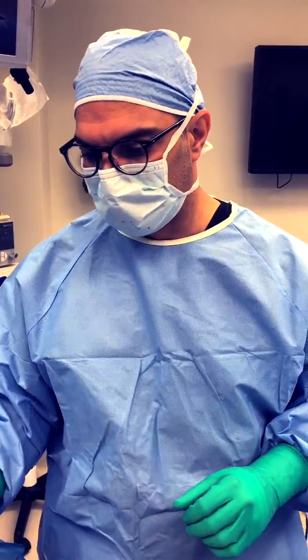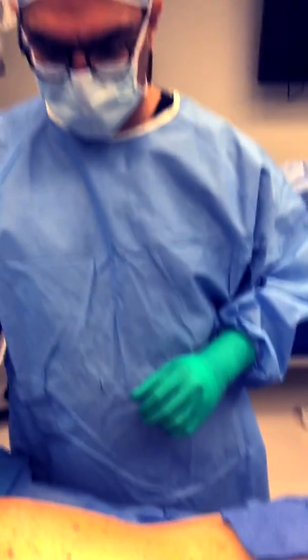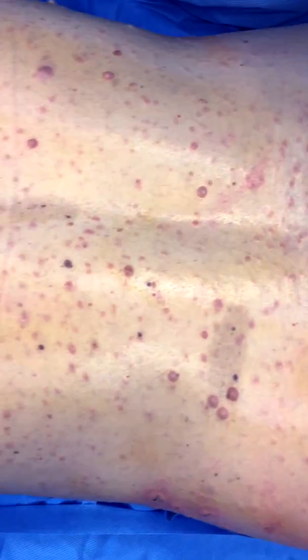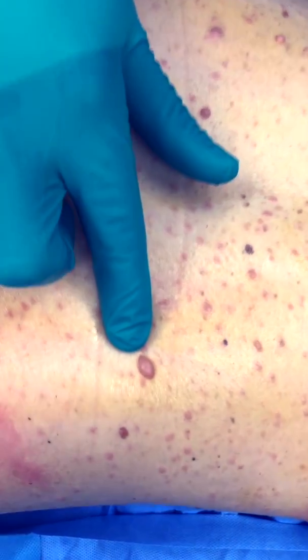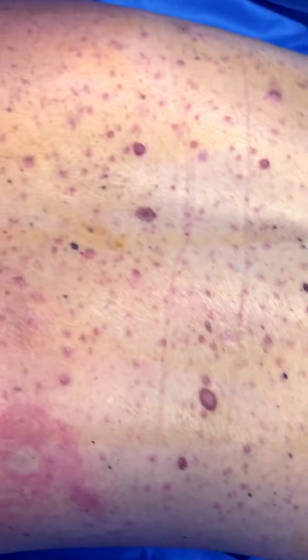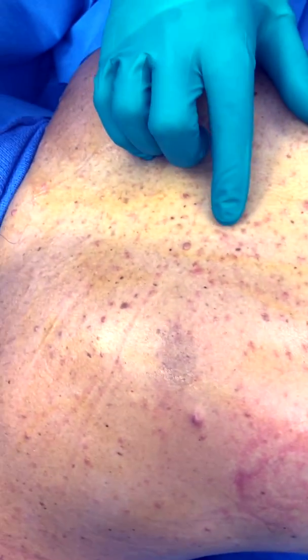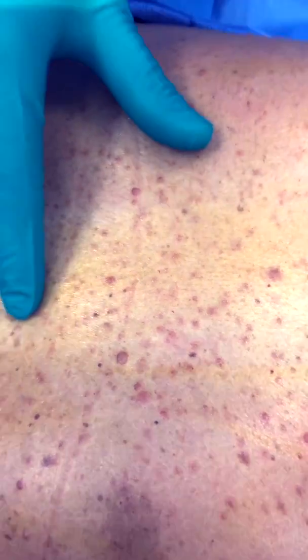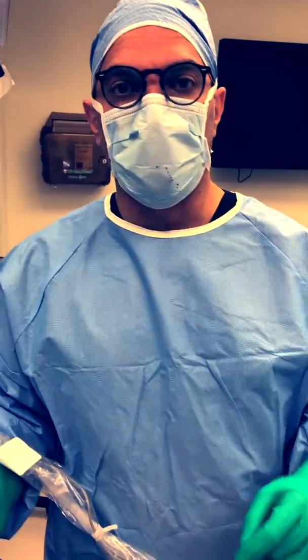Not only can we treat a large number of bumps using electro desiccation, but we can treat them early on and avoid them growing into a bigger problem. Looking at the back again, you can see bumps of different sizes. This one is probably the largest on the entire back surface, which we can excise easily, but the majority are these tiny faint precursor bumps visible all throughout the back — those are the ones we're really going after.